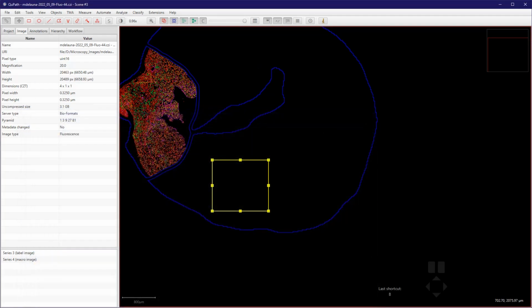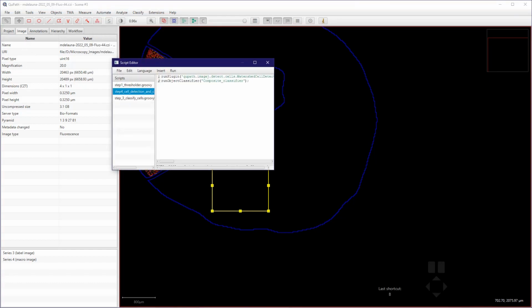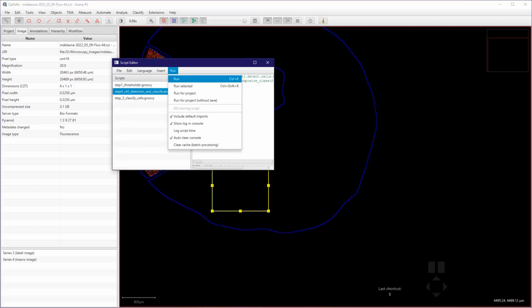Did I overwrite it? Perhaps. Let's just see what I did. Sorry. No, it's here. Strange. Maybe it just didn't update properly. I should have 4 files. It's because it wasn't in the right folder. Anyway, you can run it here. It should be put in the same folder as the other ones.